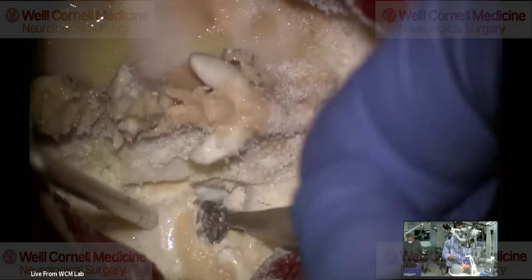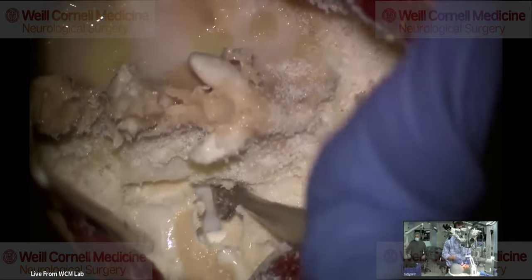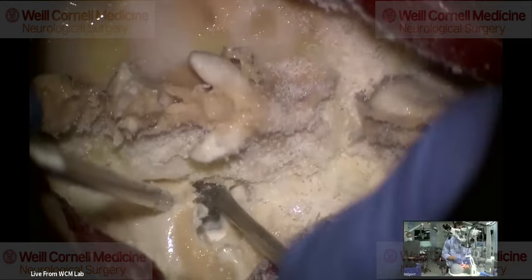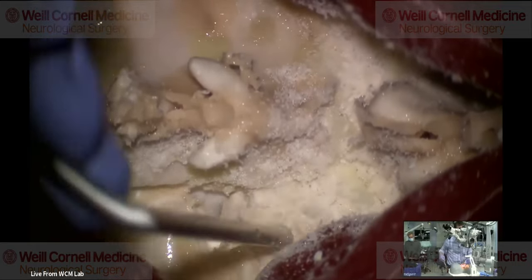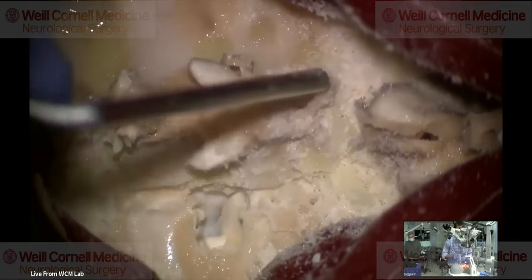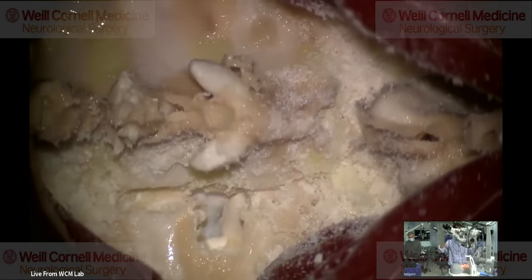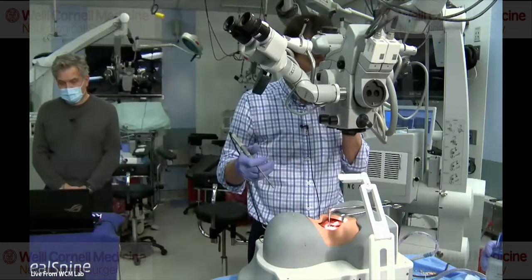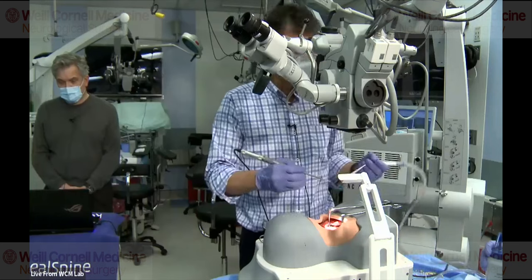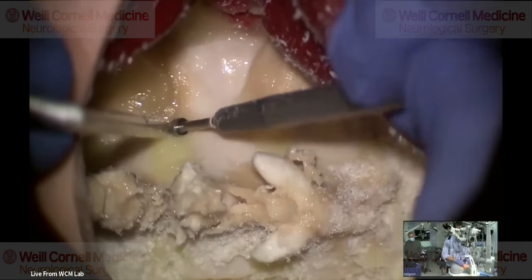You feel for the pedicle. Here's a pedicle. Your cut needs to be right around the pedicle so that it gives you the maximum amount of room. So that would be a foraminotomy. There's still enough room there to put a plate here. Then you go to the opposite side, and the opposite side is actually harder to do because on this side, you just have to go until you cut the lamina. But on the opposite side, if you do too much, then you're in trouble because it'll break.